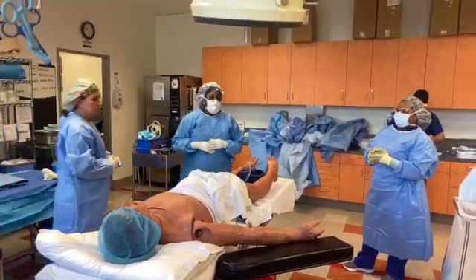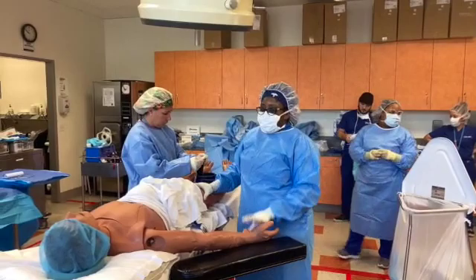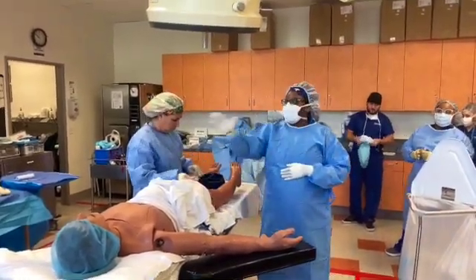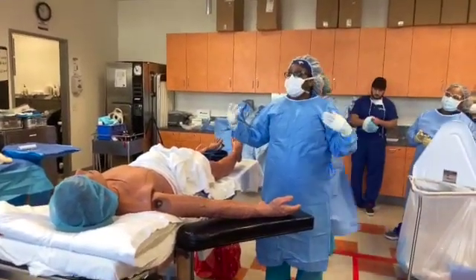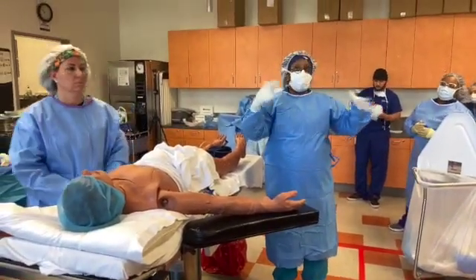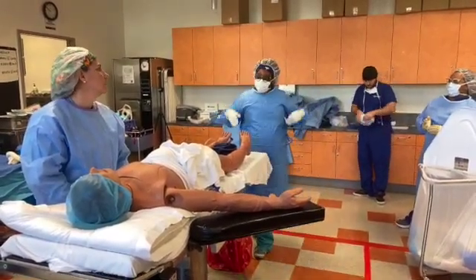And when you guys are doing this, we don't want to hear just tourniquet up. I want you guys to look, tourniquet up, 10. However long it takes you guys to do this lab, right? Tourniquet down, 10:05. Total tourniquet time, 5 minutes. So real time, okay? We don't want robots. We want you guys to really get into it.